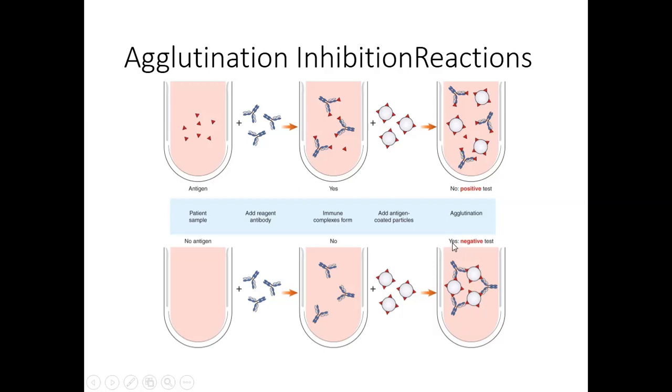Remember, these were soluble antibodies. This was a sensitized reaction, right? This makes it a lattice formation or secondary formation once we have it attached to this. So we bind it here, we form a lattice, it falls out of solution. So if yes, there's agglutination, then the test is negative for the original antigen in question. The patient does not have the disease.